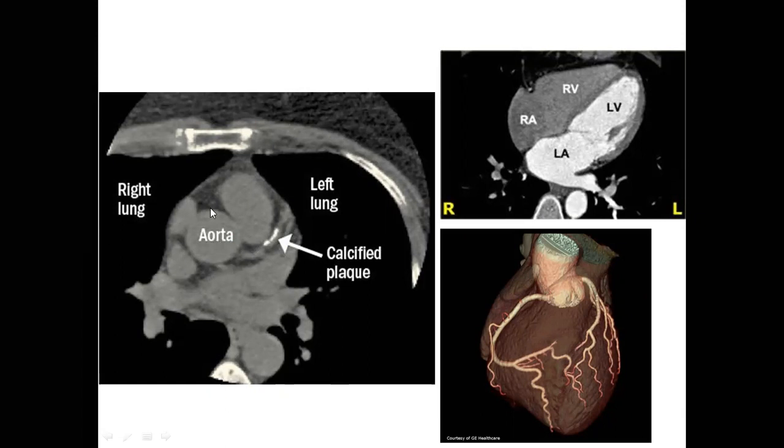However, if you look exactly, for example, here onto the aorta, you cannot distinguish where is the aortic wall and where is the cavity of the aorta. I mean the lumen of the aorta, because in this window, without any contrast, we can't understand where is what, because everything has kind of the same imaging. However, you can see surrounding structures like surrounding connective fatty tissue filling the heart right there, as well as myocardium.